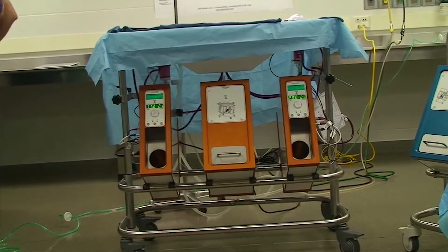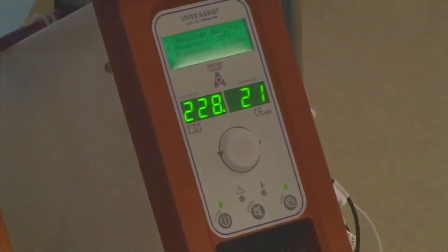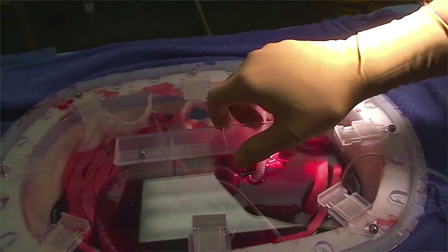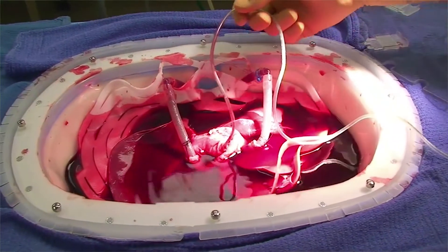The animals in this experiment did great. When we used this new system that we developed, it was night and day. You can see the animals wake immediately after the operation, the liver functions well right away, and some of the animals will jump out of the cage if you are not careful, because they feel great.